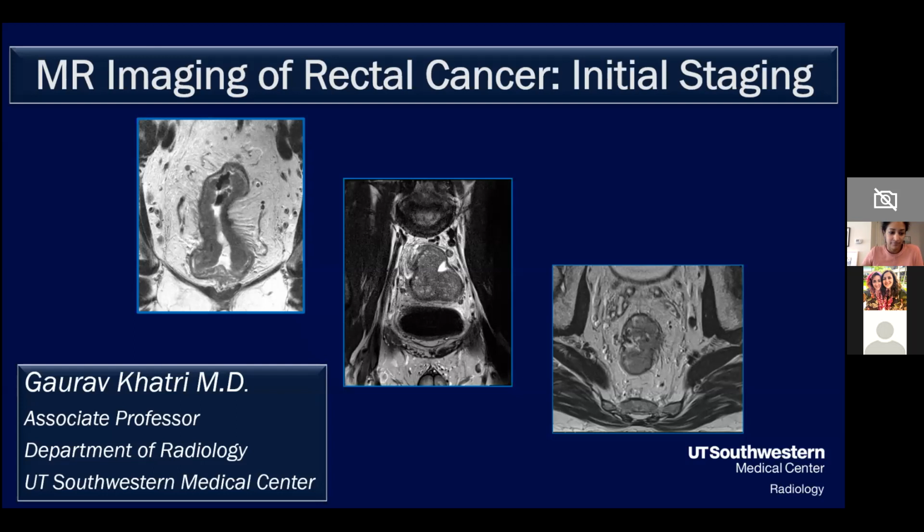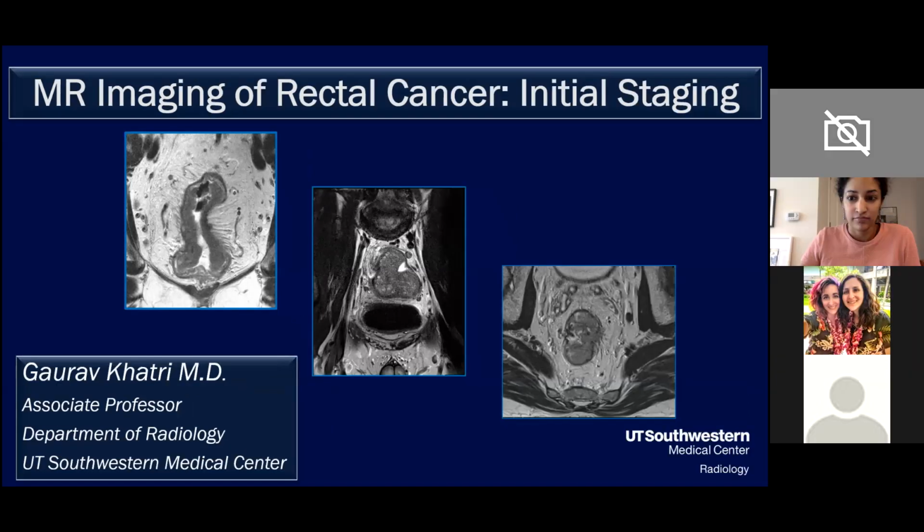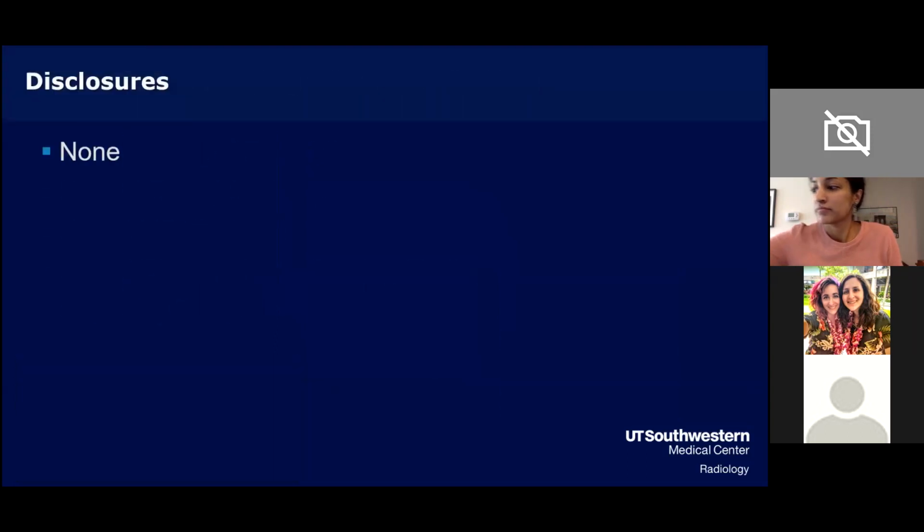Yes. Okay, great. So I'm going to do a 15 to 20 minute talk on MR imaging of rectal cancer. For those of you that read a lot of rectal cancer MR, you know this is a broad topic and tough to cover in 15 to 20 minutes. I'm going to focus just on the initial staging of rectal cancer, not the post chemoradiation imaging. So I have no disclosures.